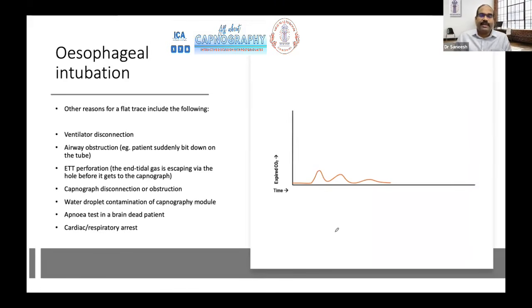So we had a scenario when an anesthesiologist intubated nasally, and afterwards there was no EtCO2 trace, and to that person's surprise, could not squeeze the reservoir bag at all. So we were all confused. We did laryngoscopy. We saw the endotracheal tube passing through the vocal cord, but zero expiratory tidal volume. The bag is too tight. So what you do is, when you don't get an EtCO2 tracing, either the tube is in the wrong place, which was unlikely in this case.